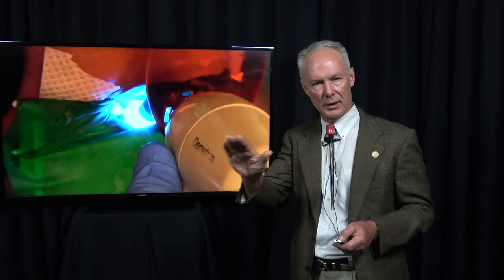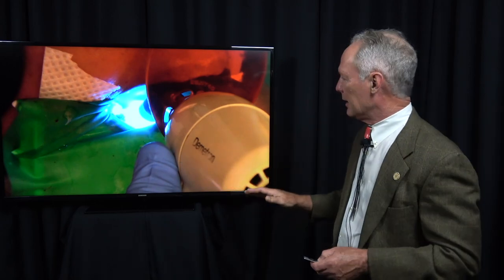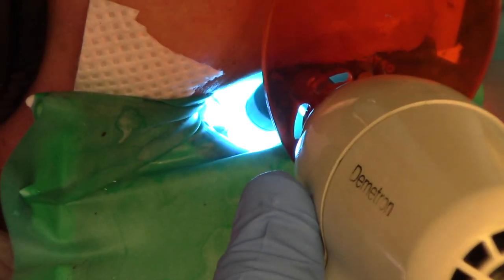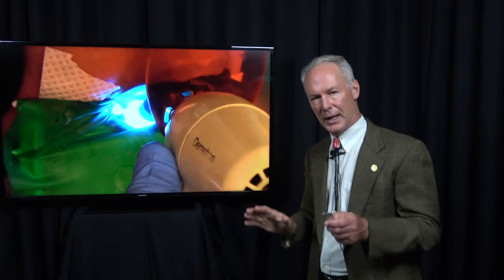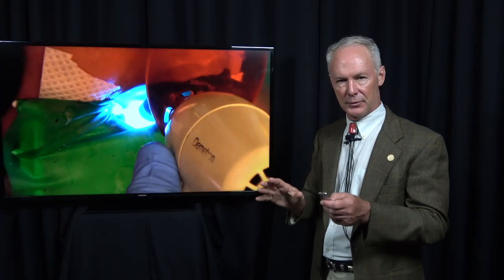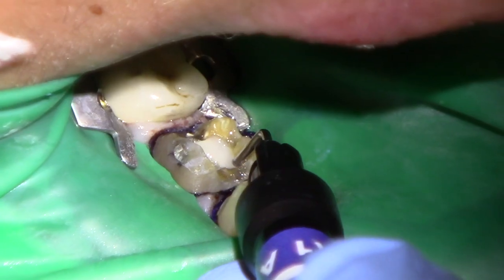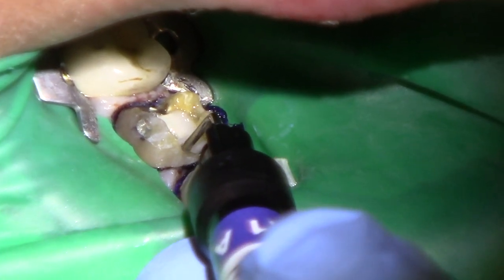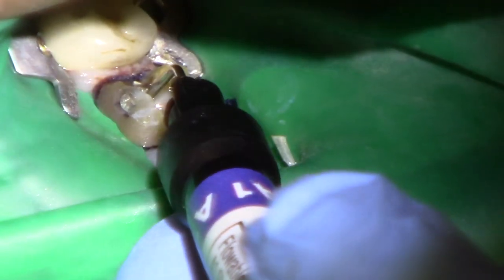I don't want to blow the gingival tissue. I just want to blow off the excess primer adhesive until nothing moves. You don't want to leave a pool of primer adhesive on the teeth. You want to blow all of it off until nothing wiggles. Then, always cure the primer adhesive before placement of the filled resin or the composite. I'm going to cure that for about five seconds.